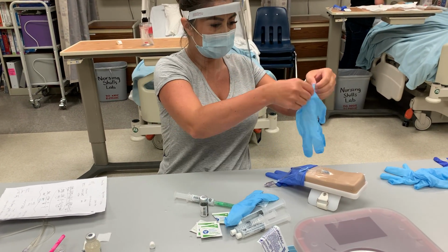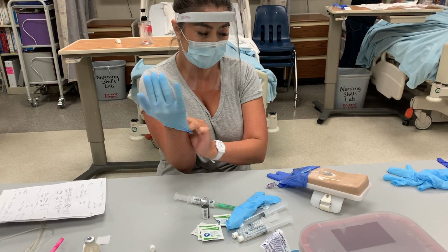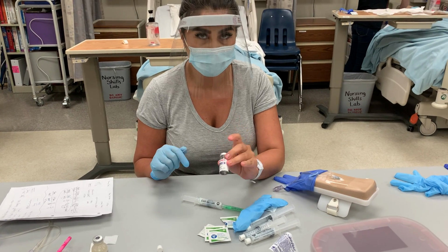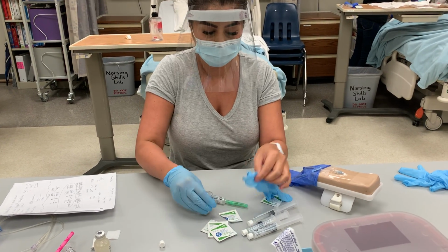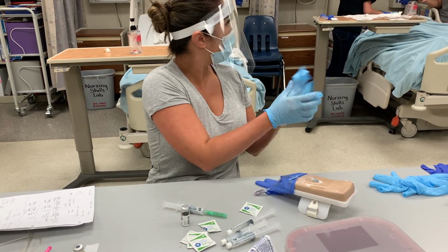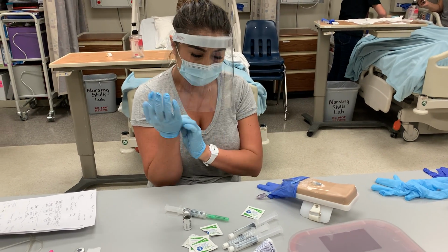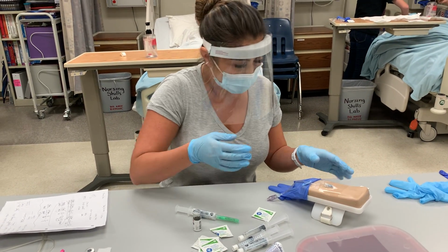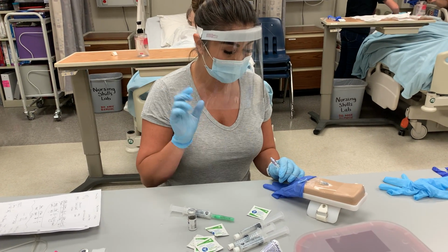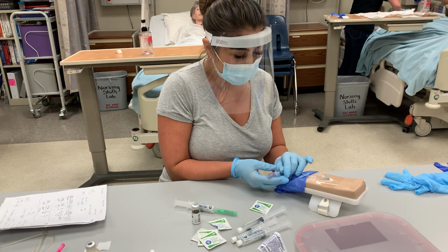Let me get my gloves on. And I would scan my medication into the MAR, and I would have done my 2 checks in the med room, and then I would do my 3rd check at the bedside. Okay. All right, so I'm going to assess the IV. If there was a pump going, I would clamp it, pause the pump. In this case, we have a saline lock.